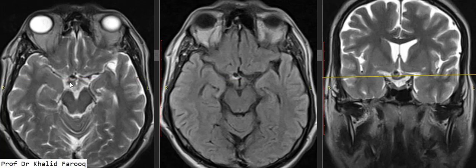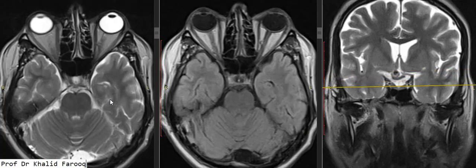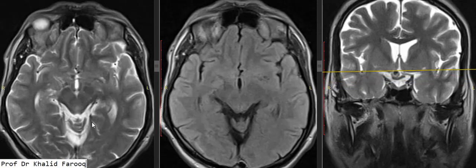So this is the area of the optic chiasm. Whenever a patient presents with the history of visual problems, we will have to trace the entire course from the optic nerves up to the occipital lobes.